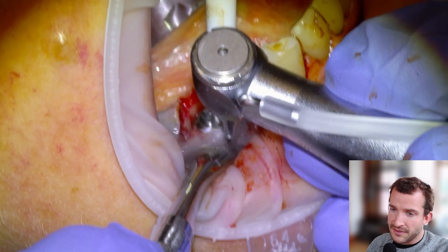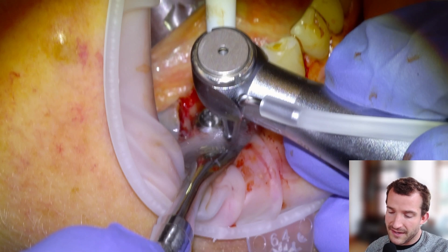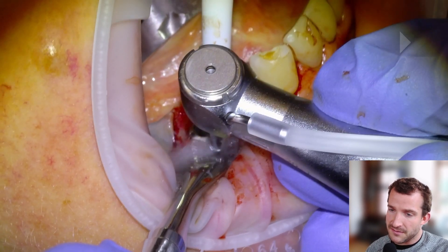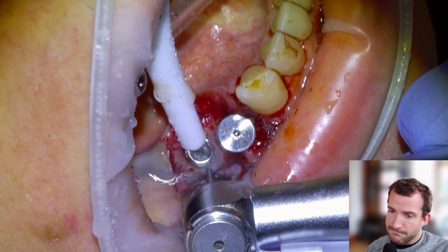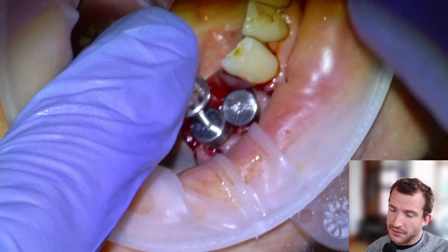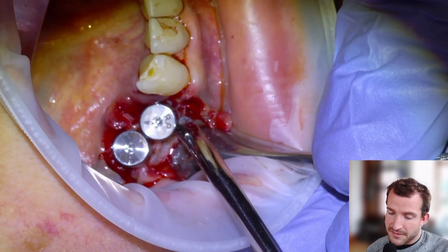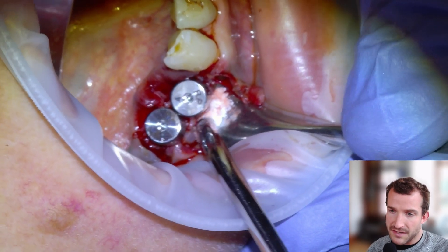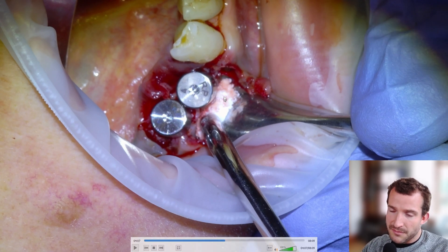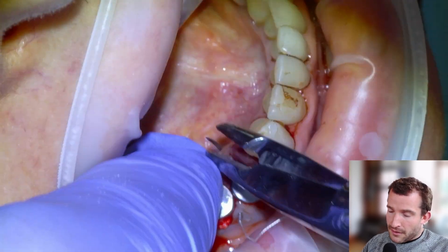You can see the 4.4 implant is a little bit tipped. This is something that sometimes happens if the collar gets buried too deep, such that the healing cap will bump into the bone. Sometimes I have to go in with a round burr after and remove bone so that the healing cap will seat fully — otherwise you'll end up with a healing cap that comes unscrewed, and you'll have to get the patient back, freeze them, cut tissue and bone away, and put the healing cap back on. I think the bone was a little bit thin on the buccal side of the 4.4, so we're just going to put some Cerasorb M into that site and then cover it up. No membrane required with primary closure like that.